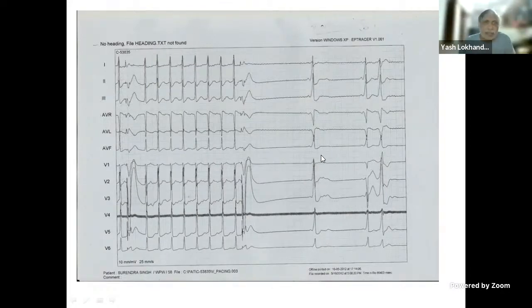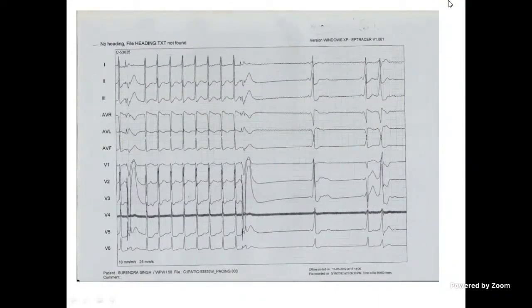Suppose I were to say now, that can be the last point before we wind up. This is really for the platinum medal beyond gold. I say why people with WPW also can have AVNRT. So why can a single PVC not terminate AVNRT? Can anybody answer that? Not cannot, but it's very unlikely that a single PVC will terminate a typical AVNRT. Suppose I say, look at that pseudo S in lead 2. This is a typical AVNRT. So why is a single PVC very unlikely to terminate a typical AVNRT? Sir, I said typical AVNRT, so please note that.